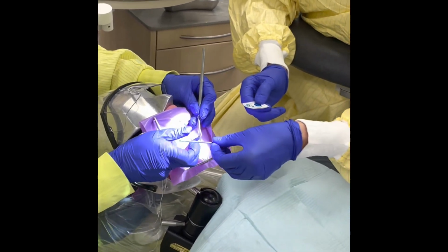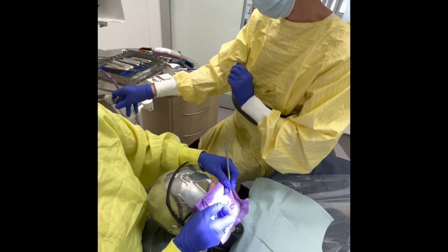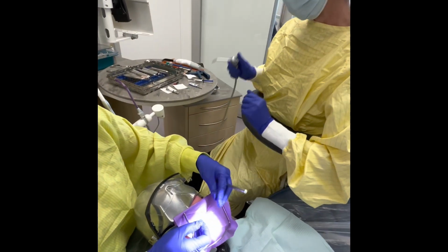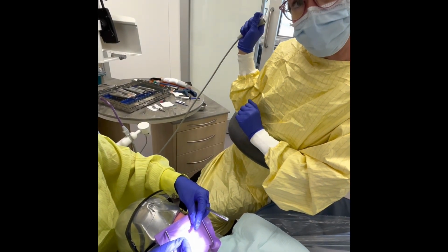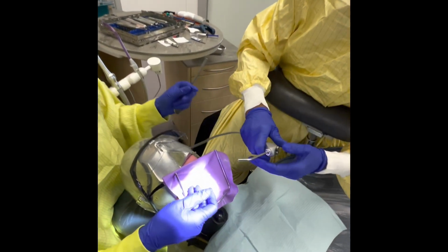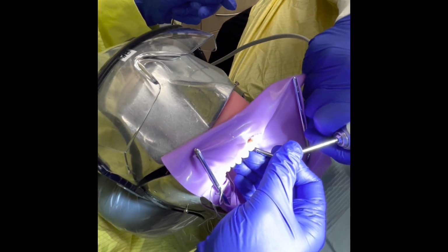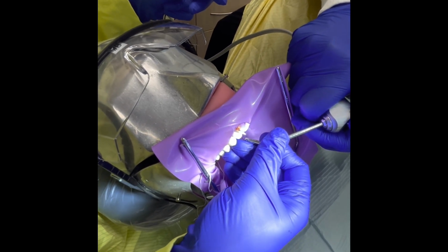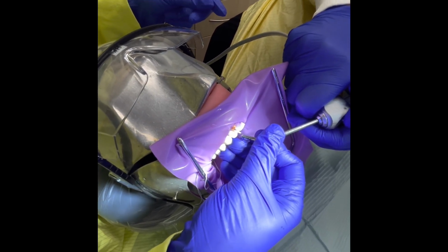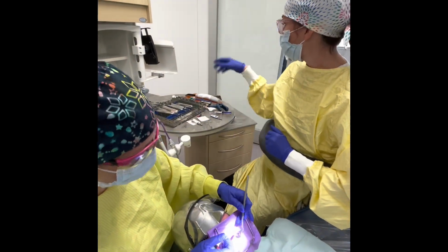Thank you. Now the bonding sequence requires that I air dry that for 5 seconds. So I'm going to grab my air, and I'm just going to give it a couple little puffs so that I ensure I don't put any water into the prep. I'm going to come in here with my air, and Amanda is going to guide me. And for 5 seconds, I'm just going to blow a light stream of air. So 1, 2, 3, 4, and 5. Good. And then what I need to do is cure for 10 seconds.